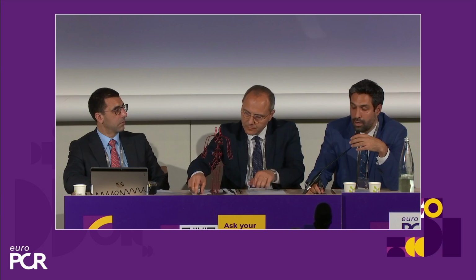Okay, let me just address this as quickly and a very easy point to remember. So if you're using physiology to understand what you have done, and you measure post-PCI FFR, in the right coronary artery, in the circumflex, after a perfect stenting should be 1. In the LAD, it cannot be 1 because the patient is lying down on the table, the LAD is going up, there are hydrostatic forces that mathematically it's impossible to have a 1. So the highest possible FFR in the LAD is 0.95, 0.96, depending on the morphology of your LAD. So that's a bit the message, Emanuele.